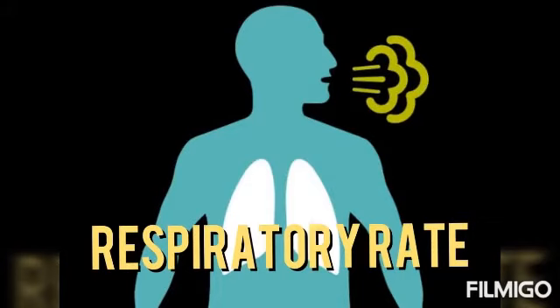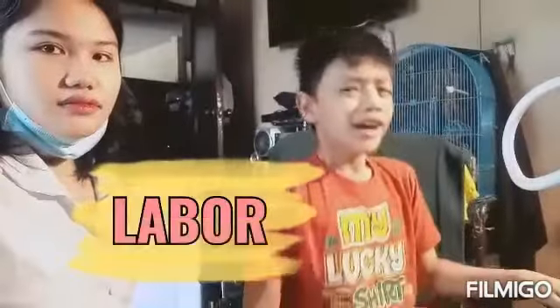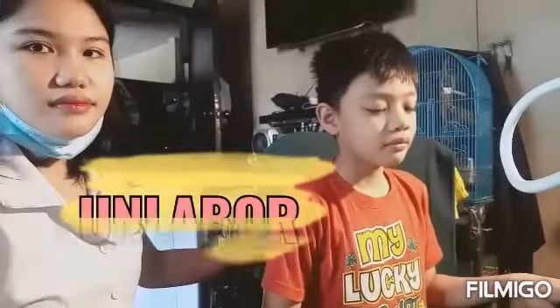Let's check Nathaniel's respiratory rate. In taking the respiratory rate, there is a lot of factors to be considered. First, let's determine if the breath is labored or unlabored. First is the labored breath. This is when a patient is using their mouth to breathe. And then we have the unlabored breath. This is when a patient is using their normal way to breathe.